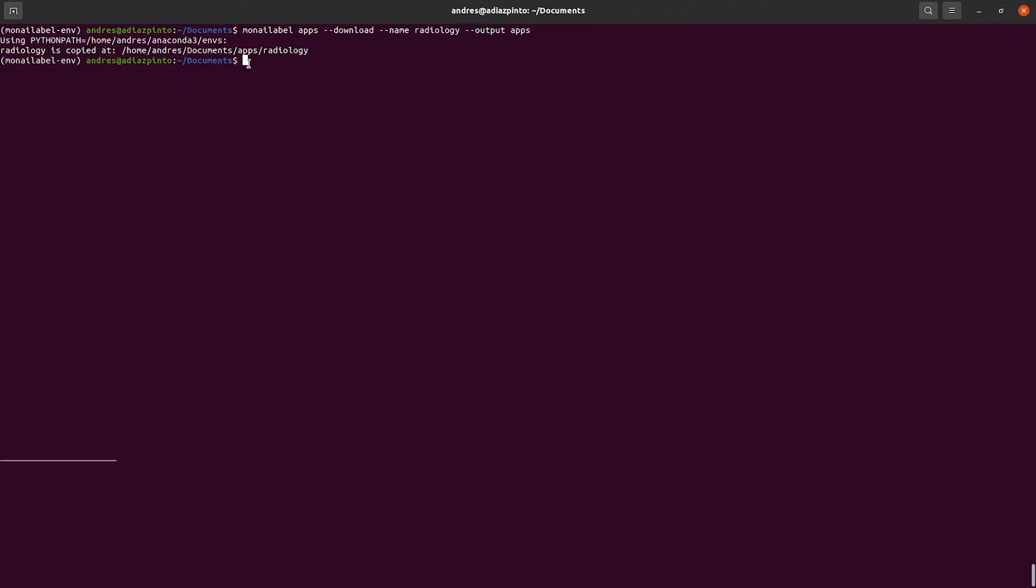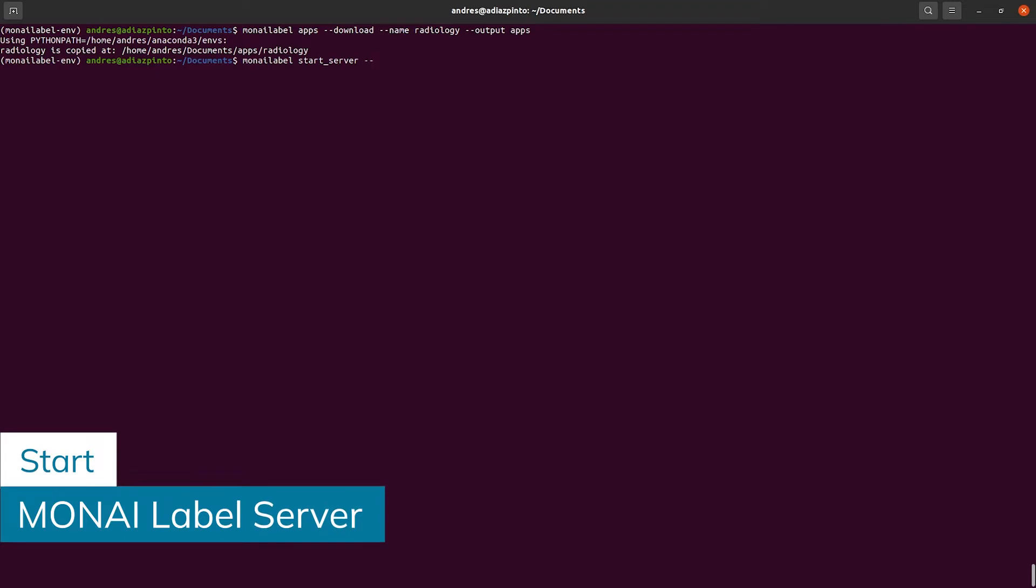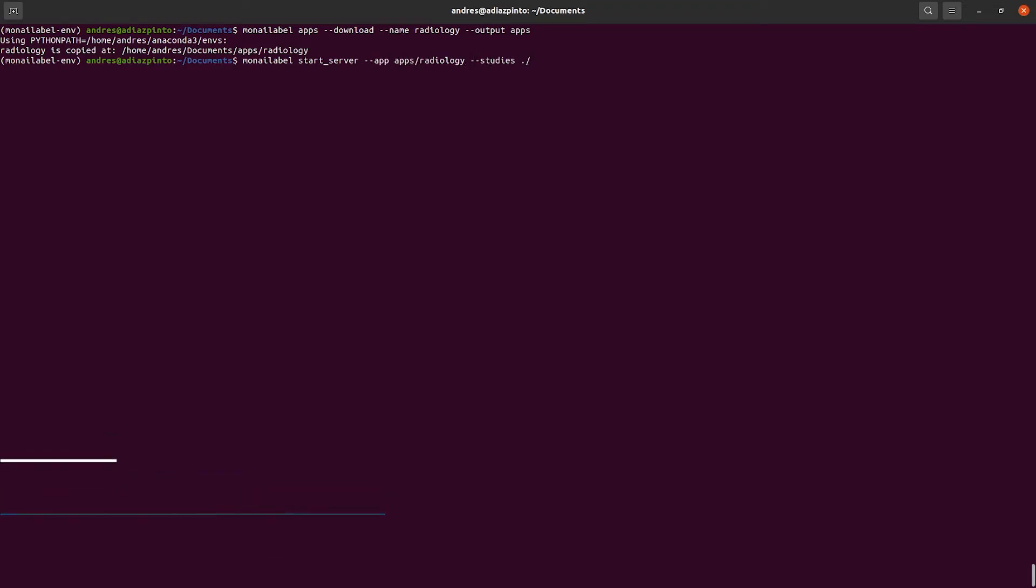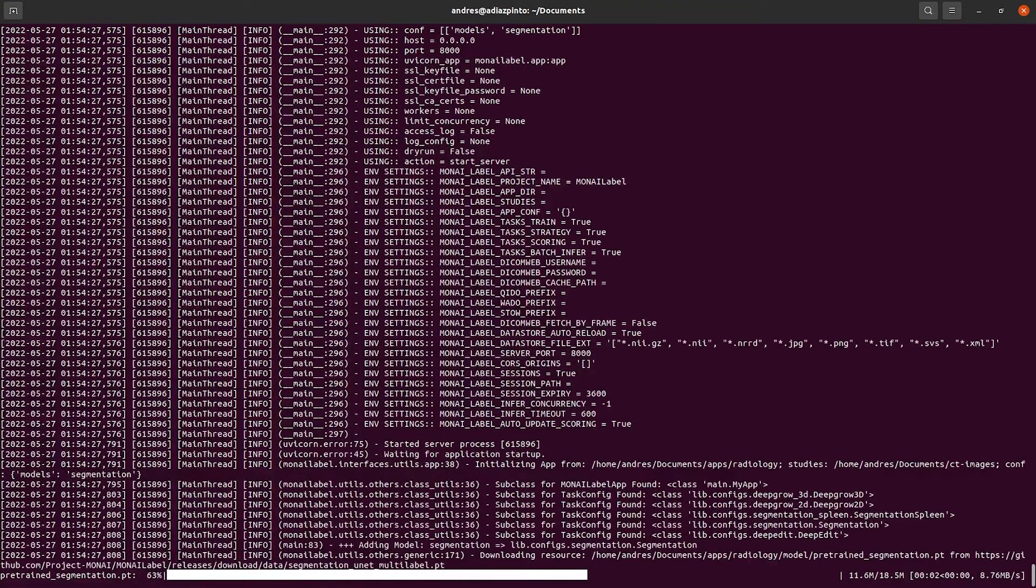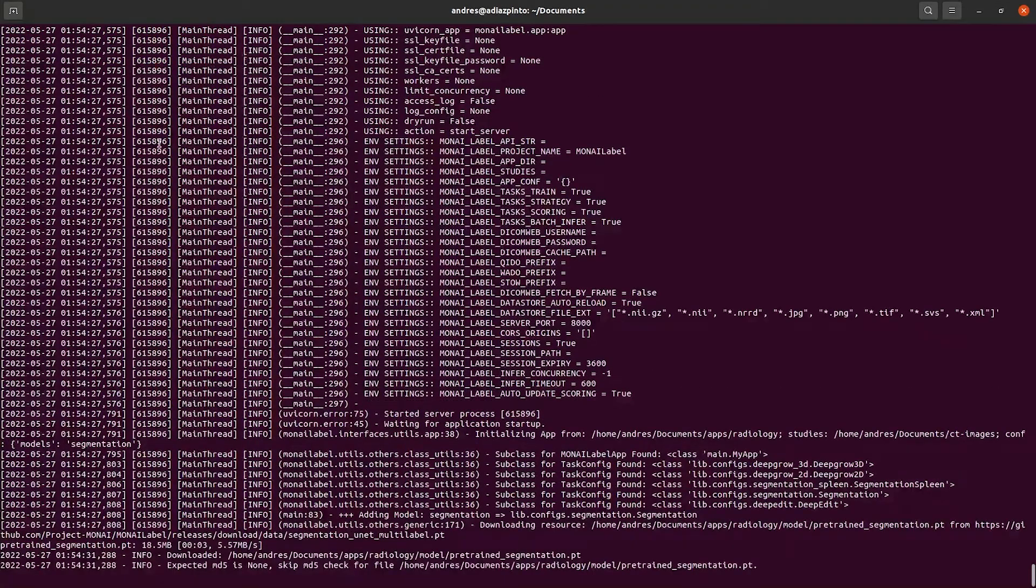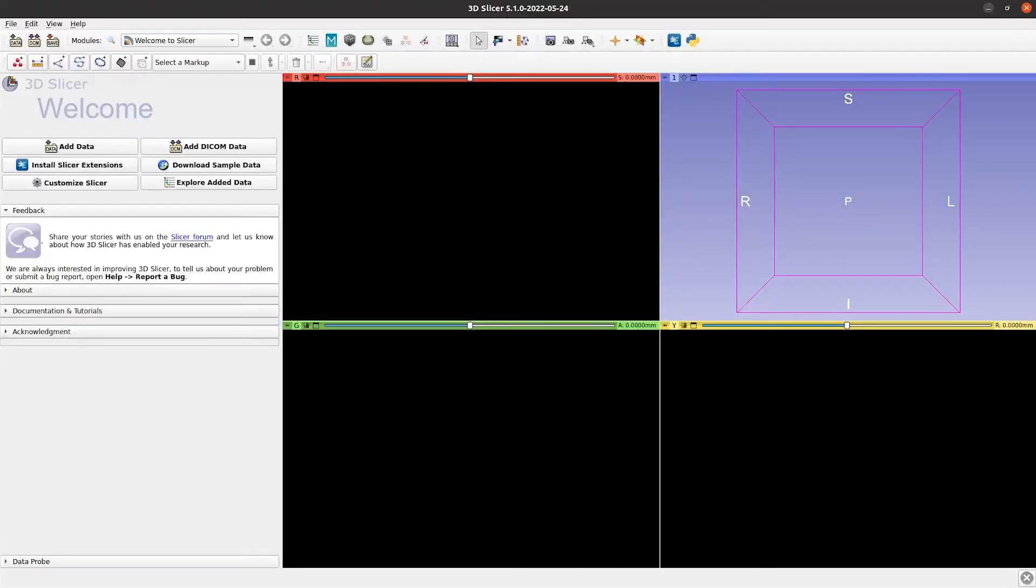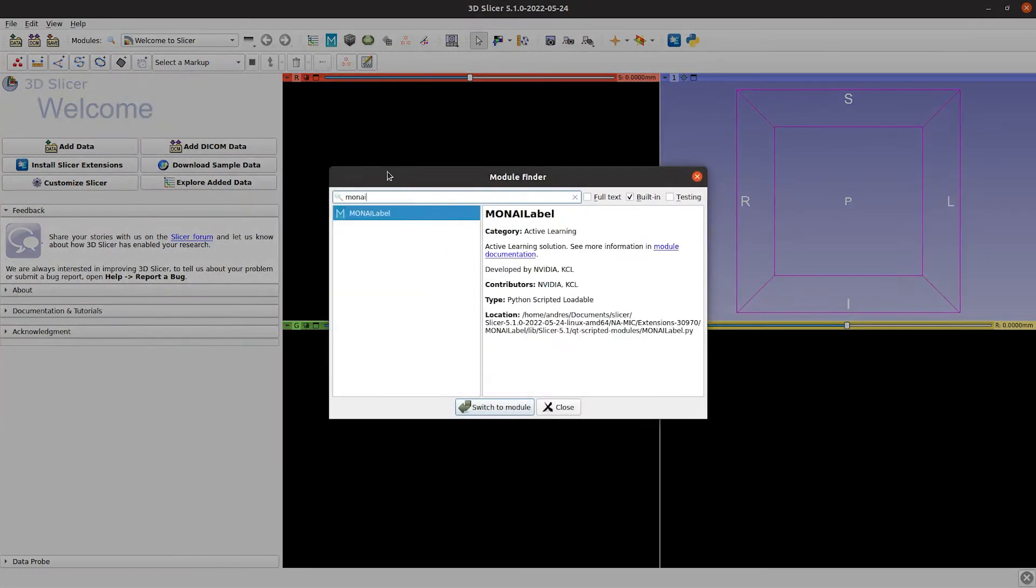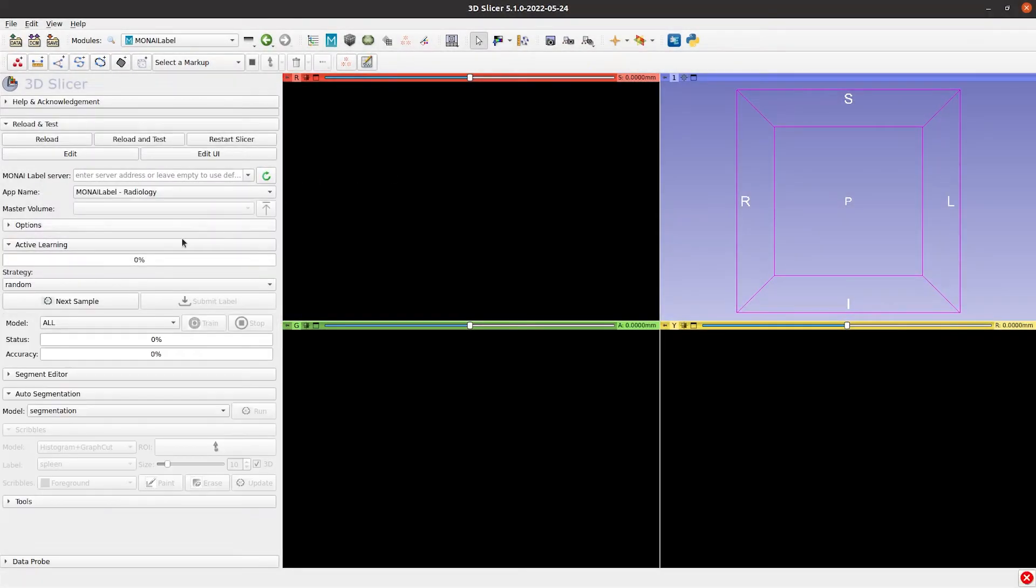With all this, we have everything we need to start the MONAI label server. As always, once we start the server, we go to Slicer, search for the MONAI label module, connect to the server, and fetch the next sample.